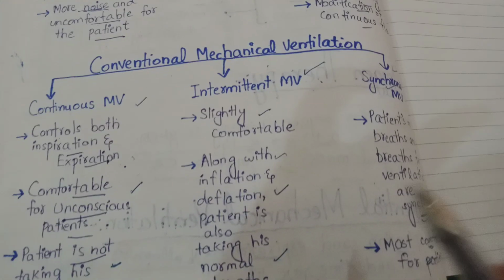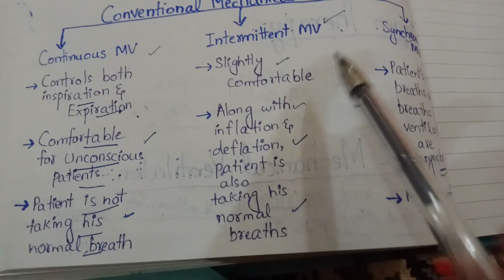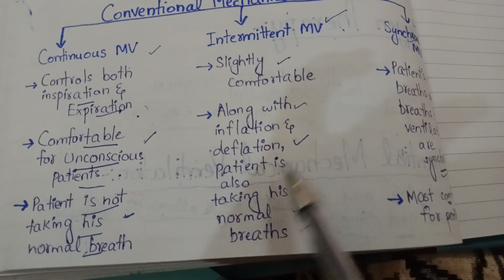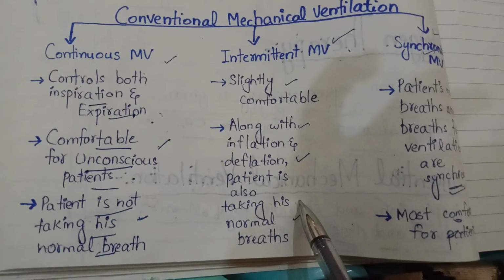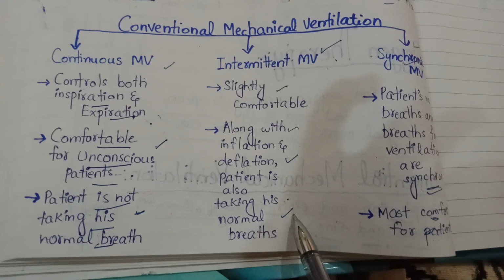Now we will discuss intermittent mechanical ventilation. Intermittent mechanical ventilation is slightly comfortable. Along with inflation and deflation, the patient is also taking his normal breath. That's why it is slightly comfortable.